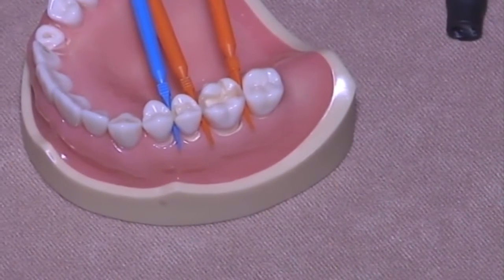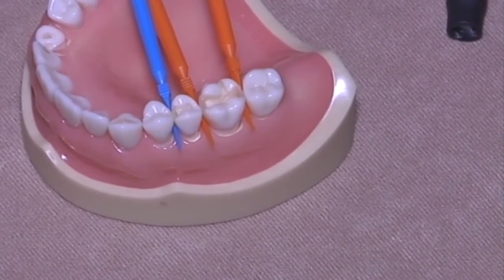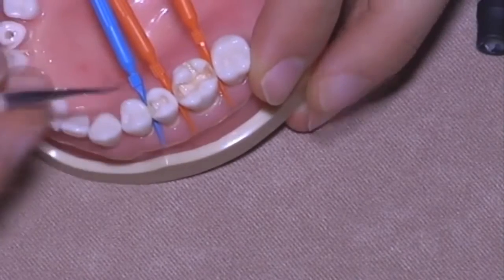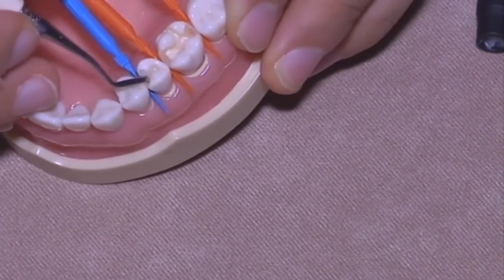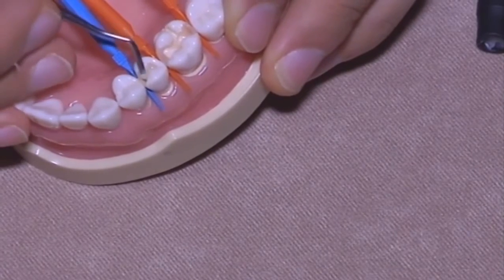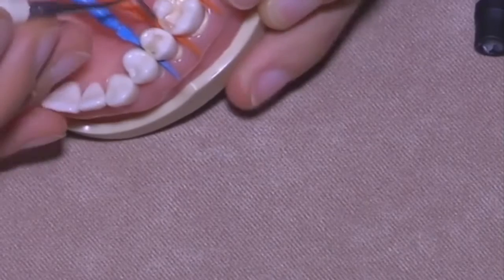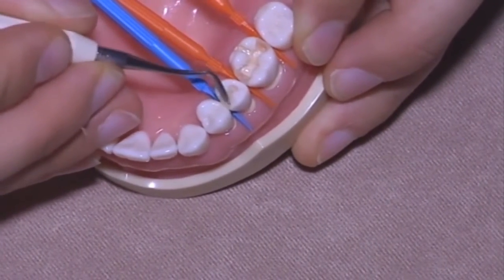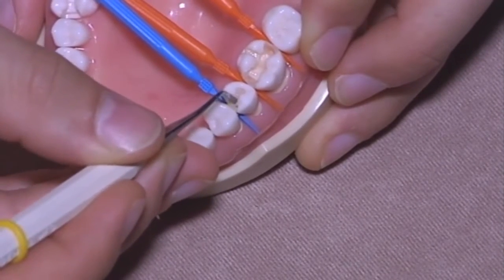So let's come back to the second premolar, and let's start layering with an oblique technique. So you just have to push, and I used to take care first of one side and secondly of the other side.